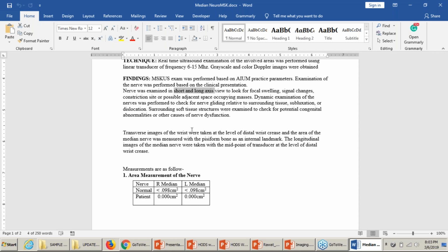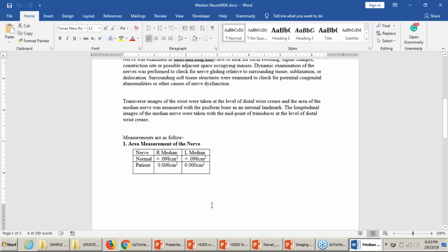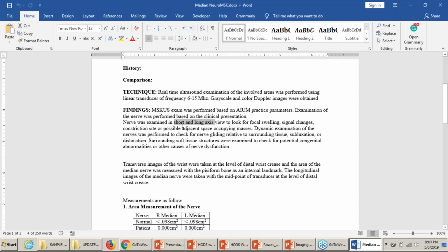We had the findings listed like that, like long head of biceps tendon LAX, long head of biceps tendon SAX, and that was just so that people know, okay, when you're following the protocol, this is your first image, second image, so it correlates with what you see on the template. But yes, short axis, long axis is SAX and LAX. That's the abbreviation. You don't have to be repetitive on that, so you can just have the structures there. And in the beginning, under the findings, we are saying we are doing short and long for everything, so you don't have to repeat it again and again.